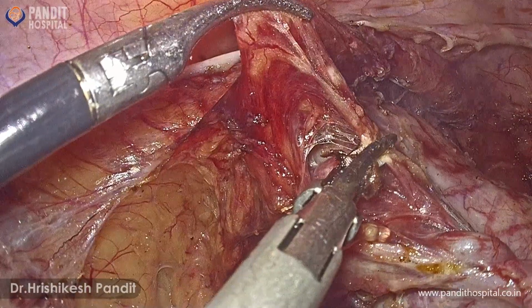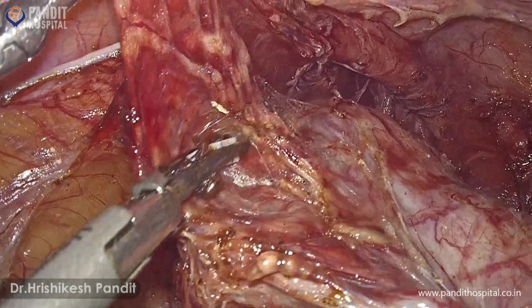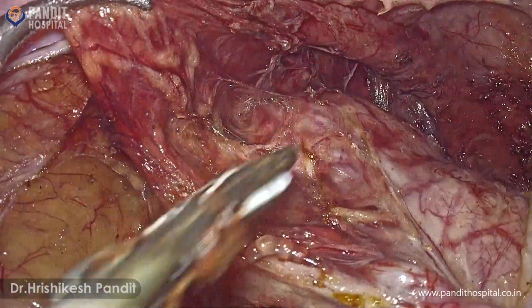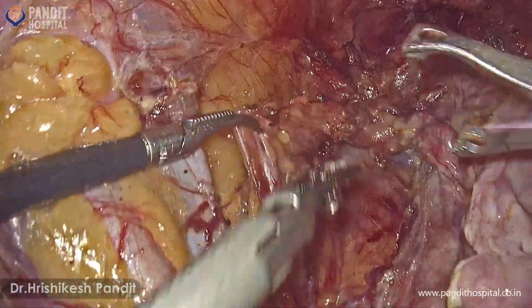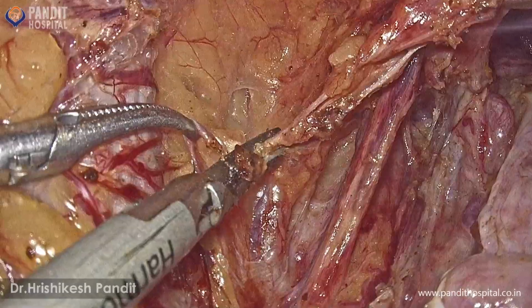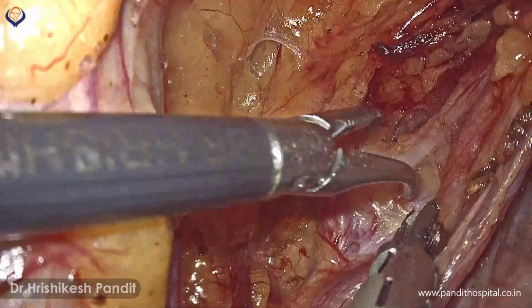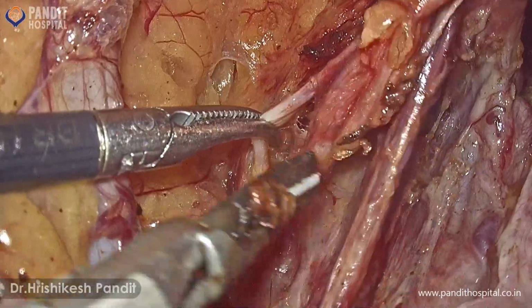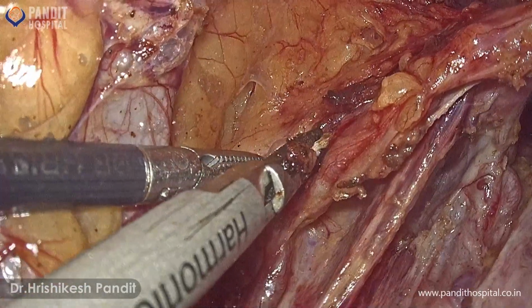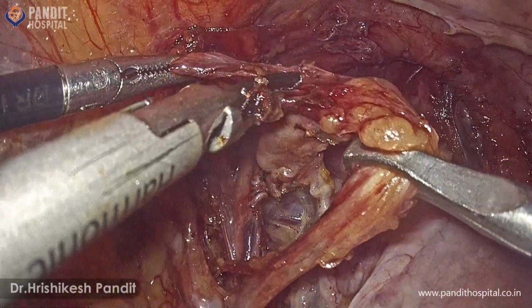Next, we are holding the uterine artery and gently pulling it up in an upward direction, and a window is created underneath. Short bursts of cutting currents are used. Uterine artery retracted by the assistant.